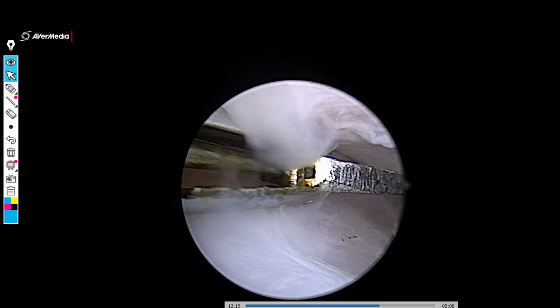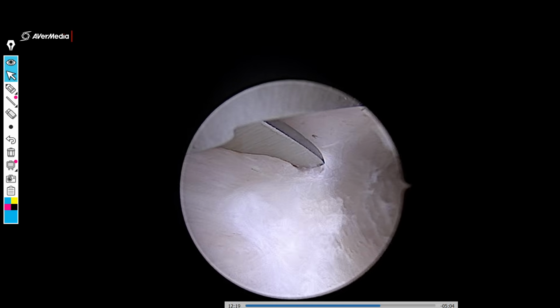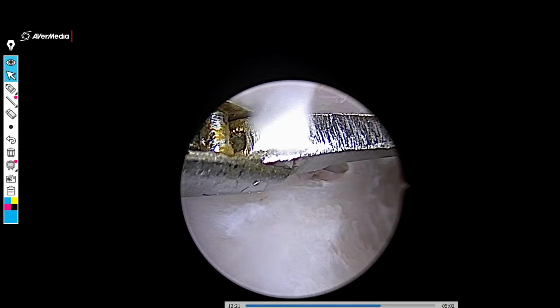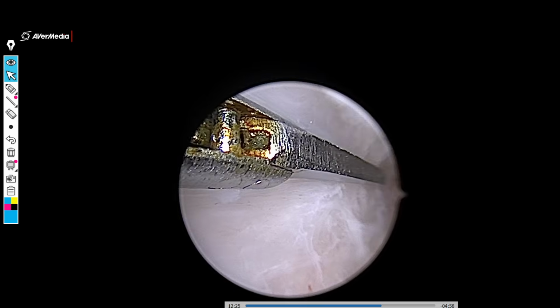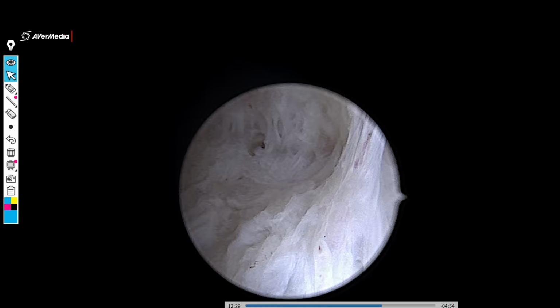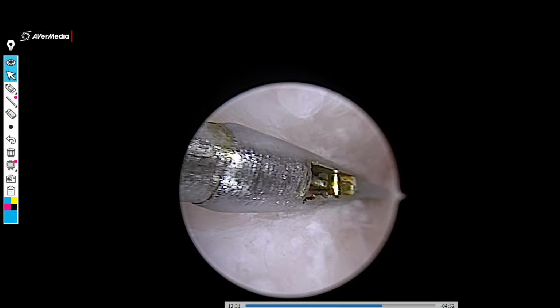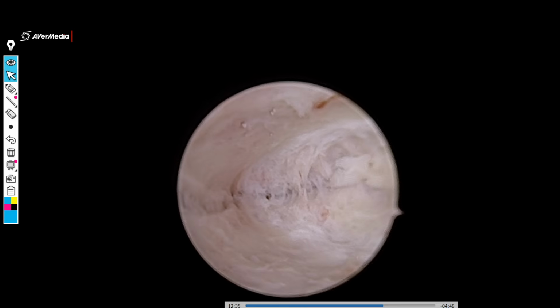Now what we are doing is a right lateral metroplasty, something that many young hysteroscopic surgeons find very difficult to do. But you can see it does not take a long time to master. You just have to insert the fixed blade of the scissor inside the cavity and keep making cuts from the internal os up to the ostium in one straight line.